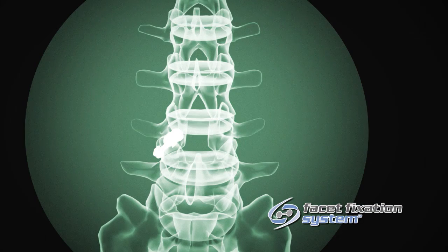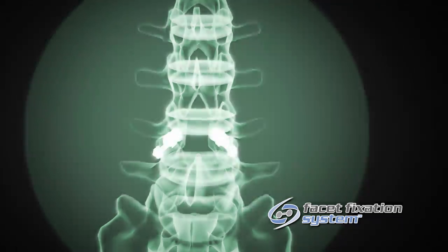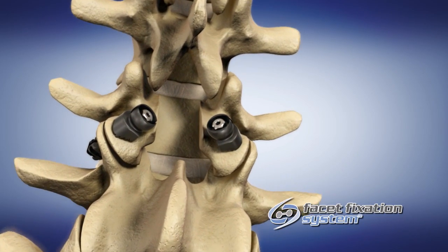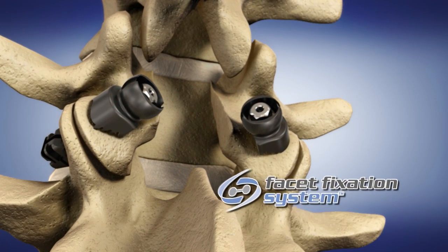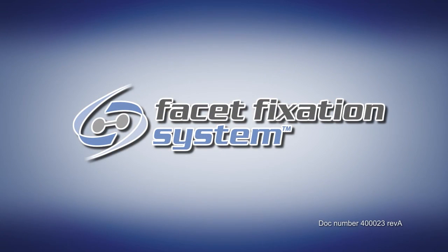The gun can now be removed from the operative site. Confirm the implant position and fixation via fluoroscopy. Repeat these steps for the contralateral L4-L5 facet joint. These steps can also be repeated for other levels as deemed necessary.